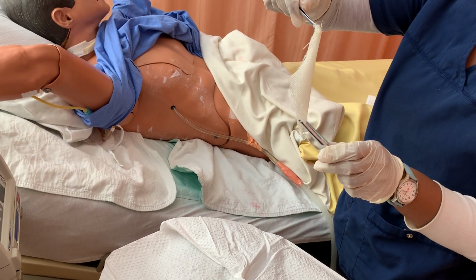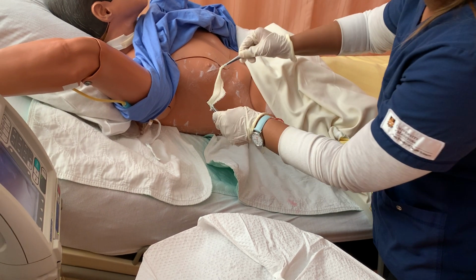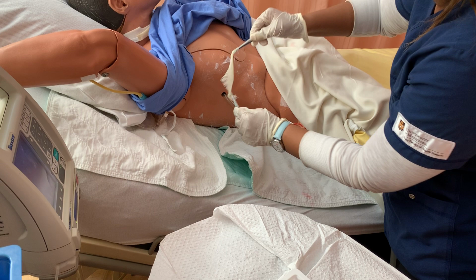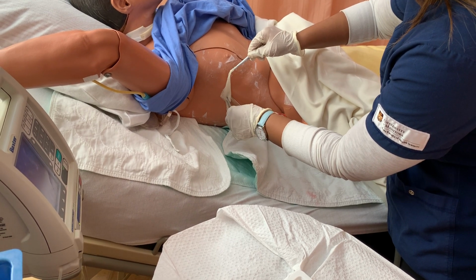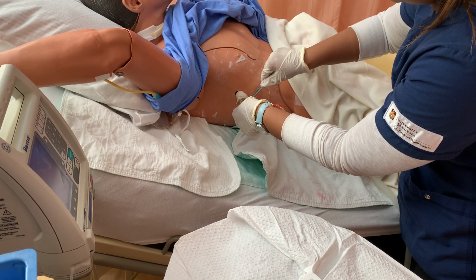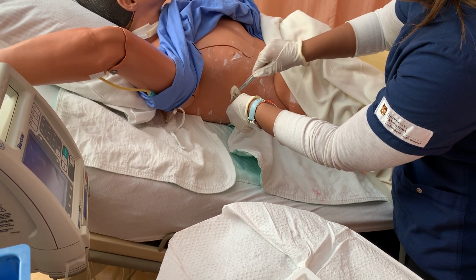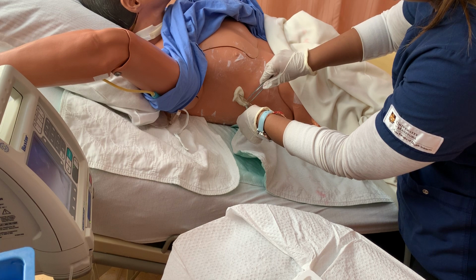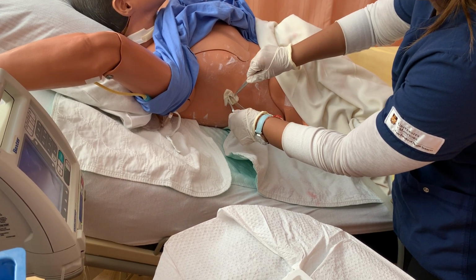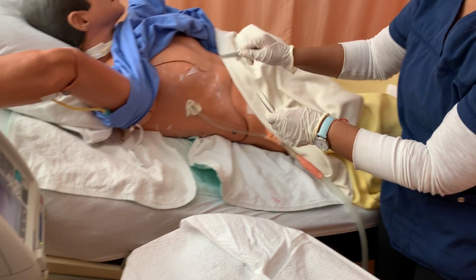You guys watch me. I can pull up my calculator. Didn't know that. I'm just gonna put it right here. Makes sense. Making sure it's nice and occlusive. 10 minutes remaining. 10 minutes remaining. And kind of just press it in. Again, making sure it's nice and occlusive. We don't want any air going in.